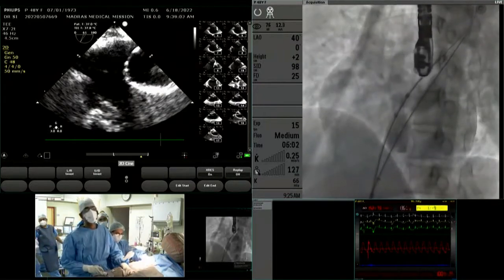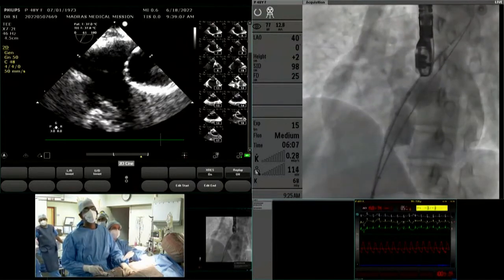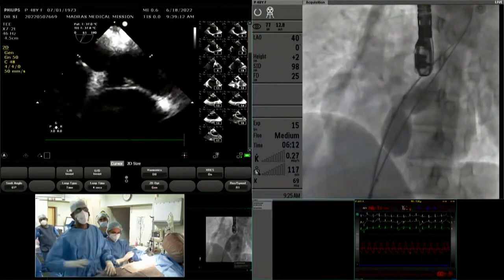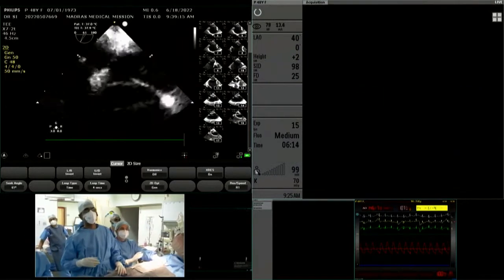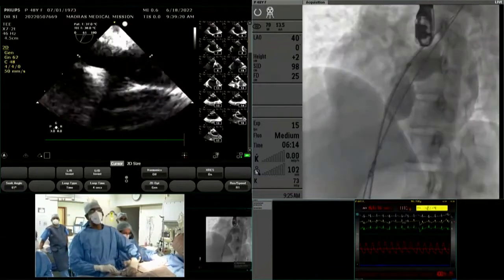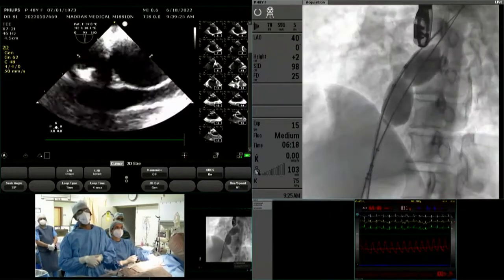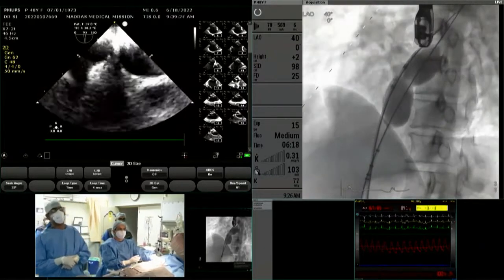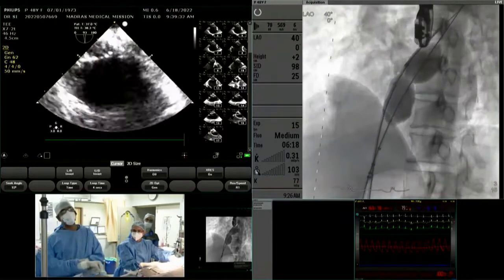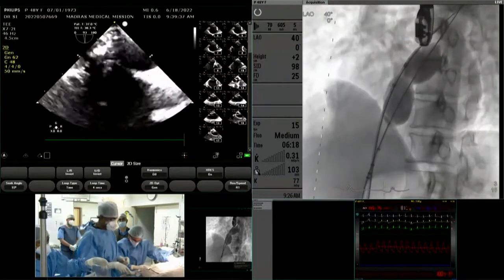In the presence of a floppy septum, don't you think this balloon sizing would be a little more than the size on the TE? But that will only give the stability, no, Sushil? If I have a little floppy septum and I have a size of 12 and I target my device for 12, and unfortunately the floppiness of the septum is not supporting my device and the device later slips through, that is the purpose of the interrogation itself. Measure this second one, measure the first one. We are taking out both.